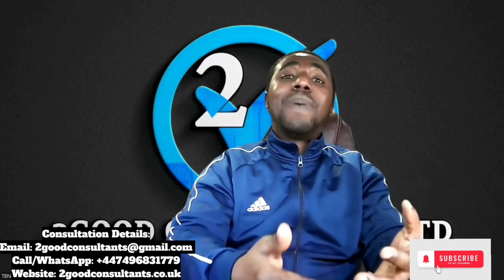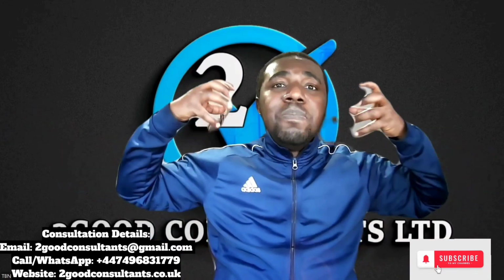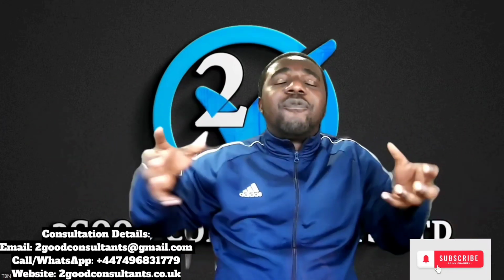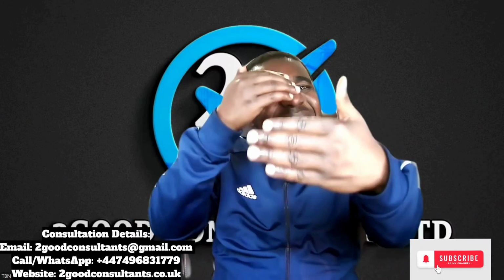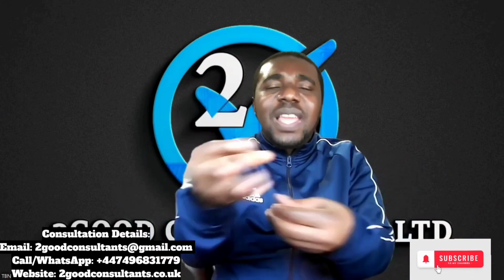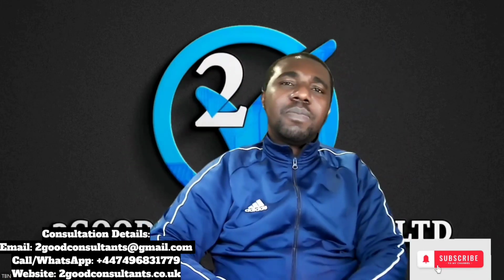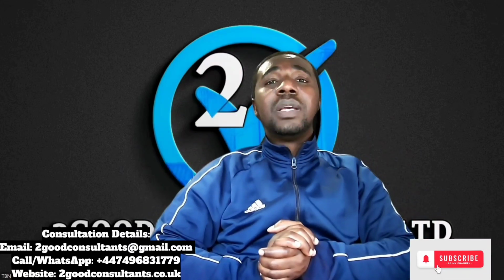So I've already explained deparaffinization. Deparaffinization means removing the paraffin wax. Okay, so when we melt the paraffin wax so that it can melt away from the tissue, thereby exposing the tissue, that is deparaffinized. So when there is inadequate deparaffinization, what do you mean? That the paraffin wax has not been properly removed, meaning that there can still be some paraffin on the tissue, and that way it will prevent the accessibility of the antibodies to the tissue, and that could contribute to poor IHC staining.